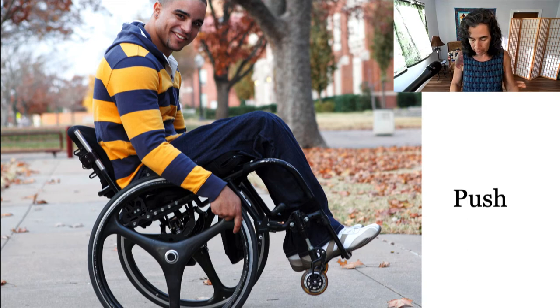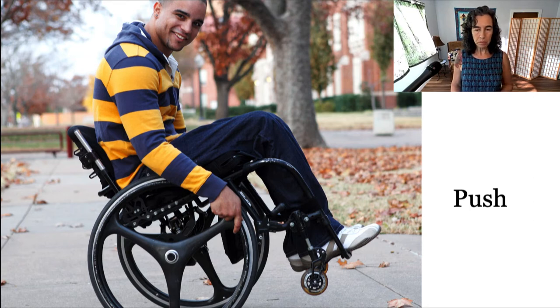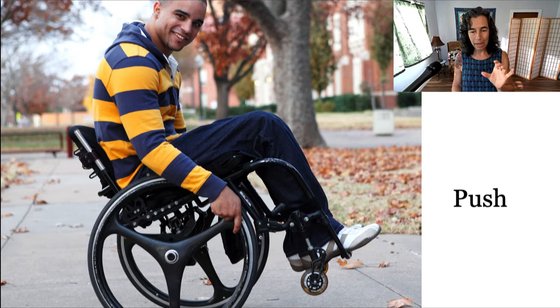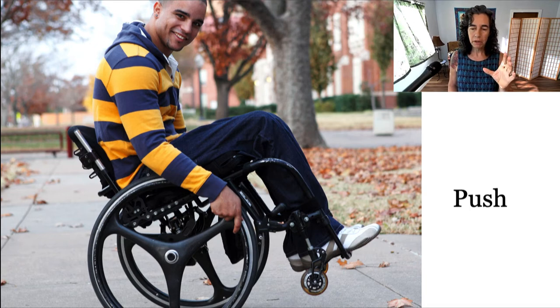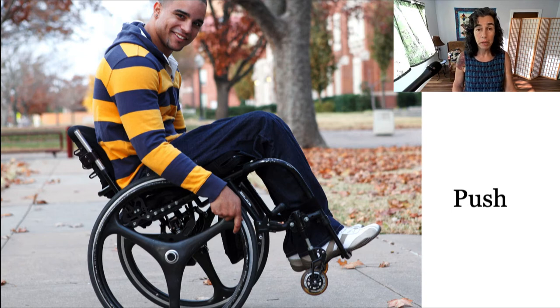And one thing that we want to consider with folks who are in wheelchairs and using that as their prime form of mobility is the shoulder integrity and not getting repetitive stress or other injuries due to pushing a wheelchair day in and day out. Notice that this person has a slightly rounded back and hip angle, and we want to, again, balance that. And he's also doing a wheelie right now. We want to balance out the considerations of force and pressure on the sacrum with the increase in ability to push. And so if somebody has upper body mobility and can do weight shifts, that's going to make it a lot easier and more effective to have a little bit more dump or rake.